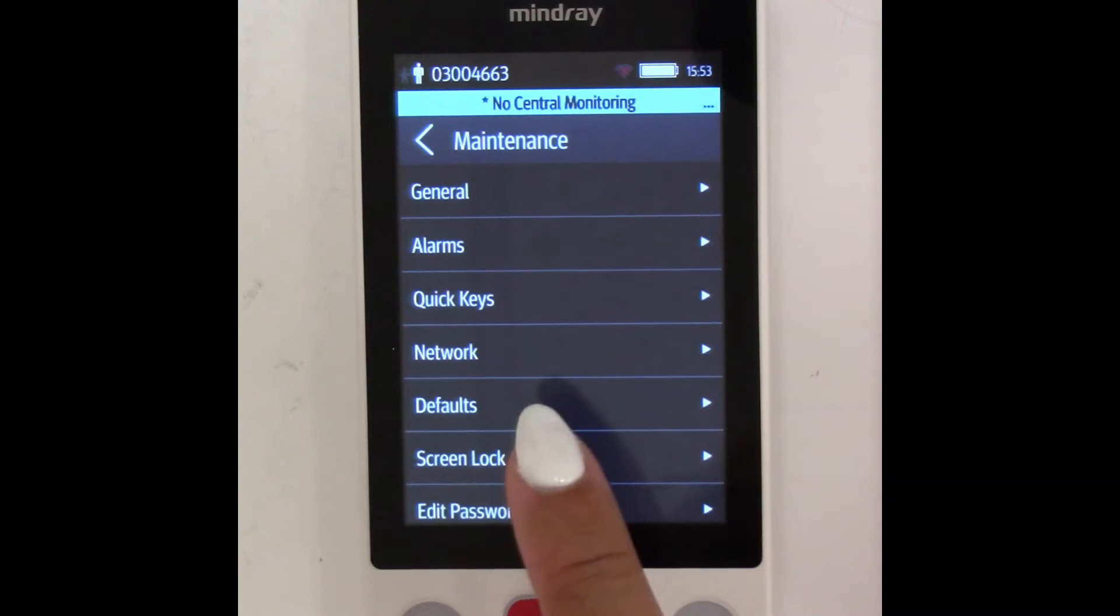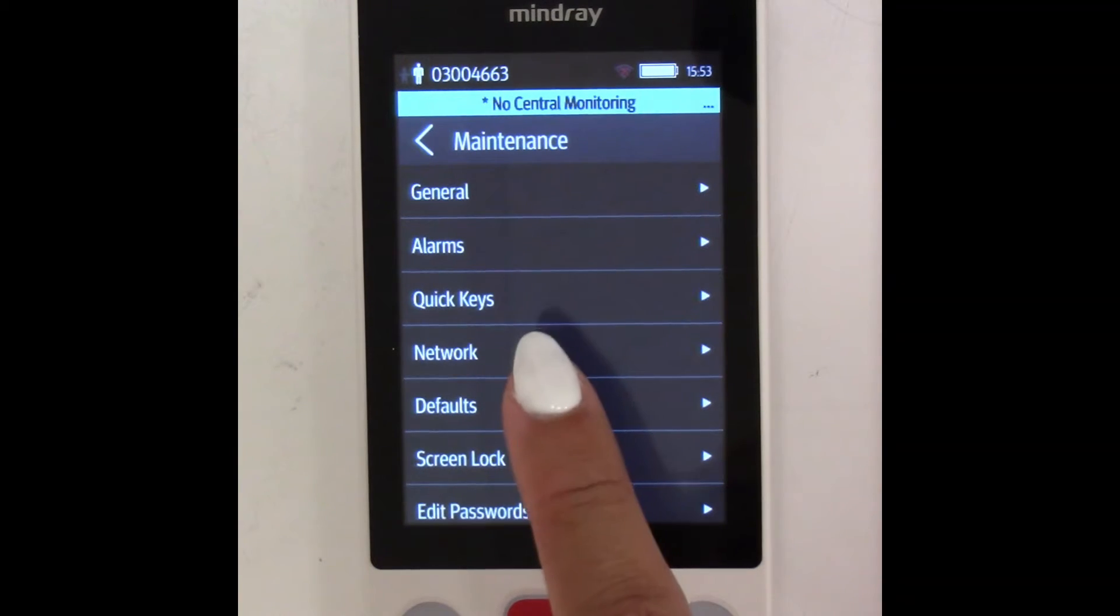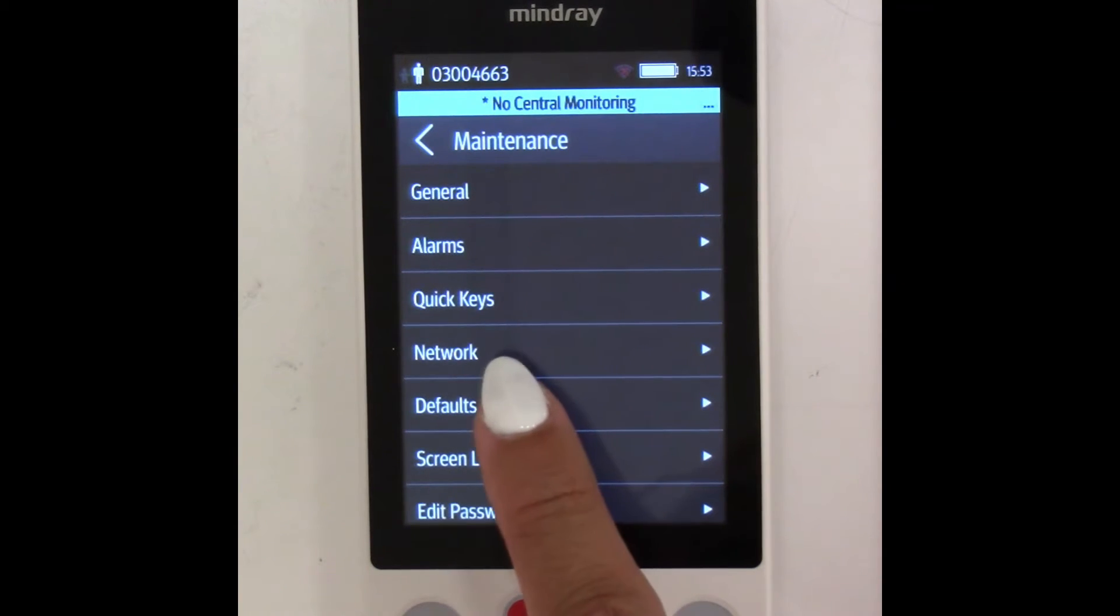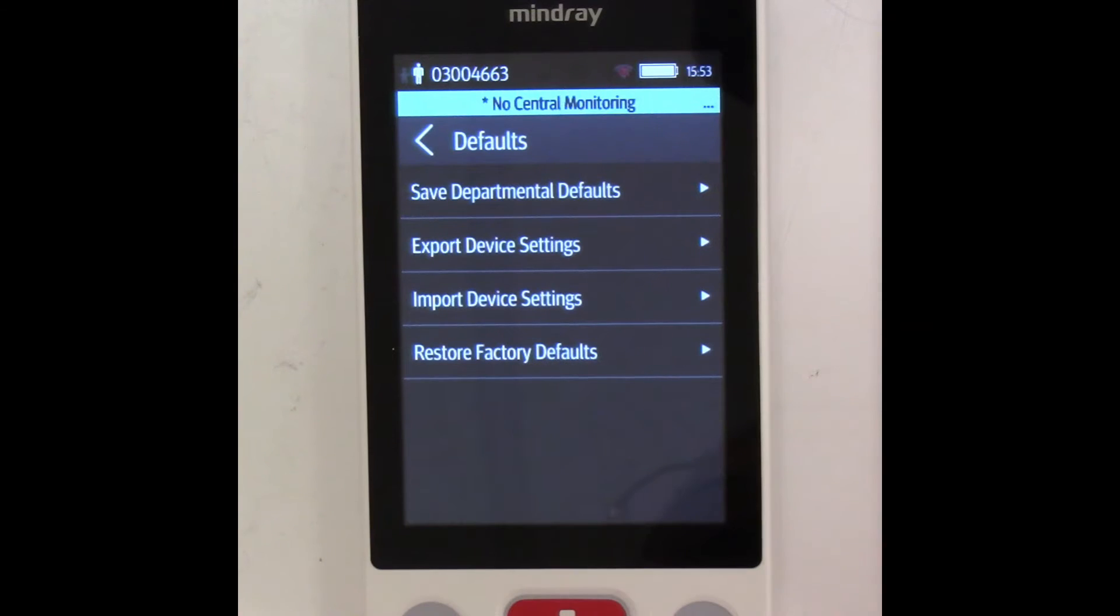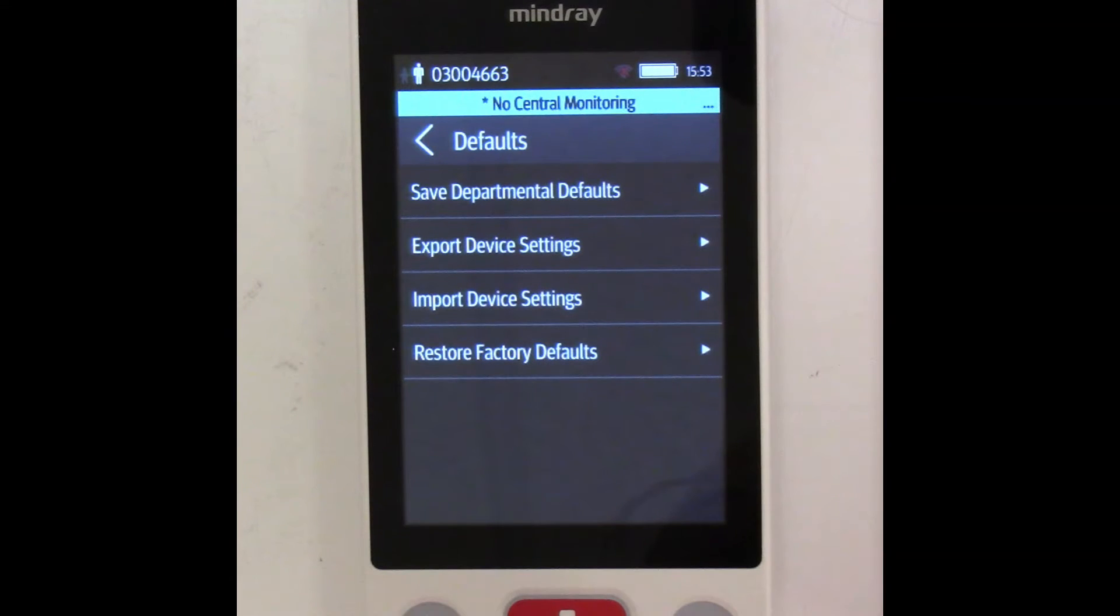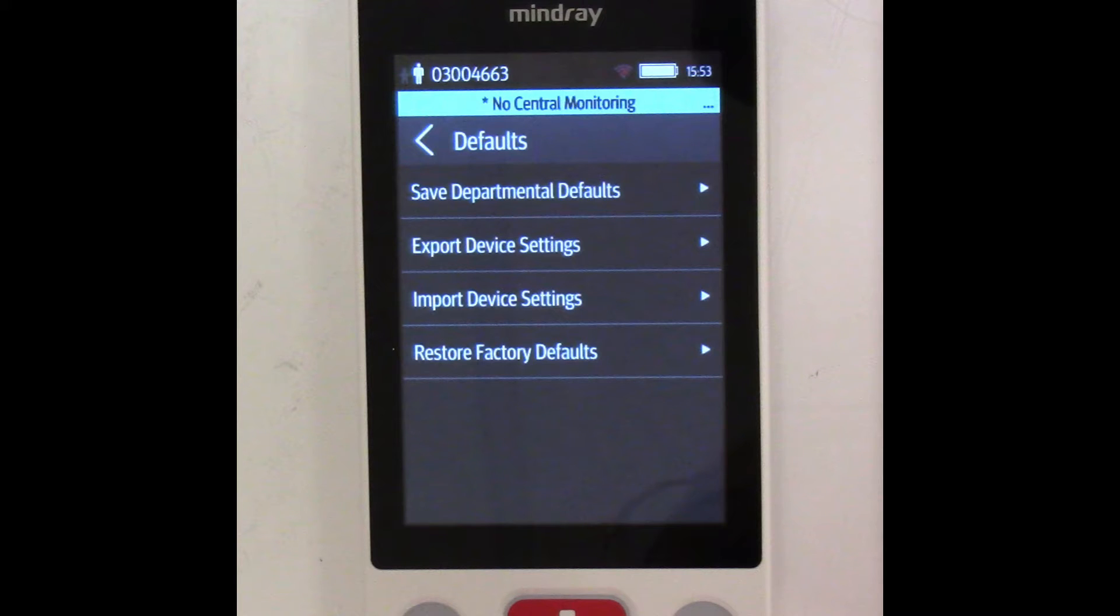In Maintenance, select Defaults. In Defaults, we are going to select Export Device Settings. But before we do that, we must have TM80B set up to receive those settings. Otherwise, a timeout can occur.